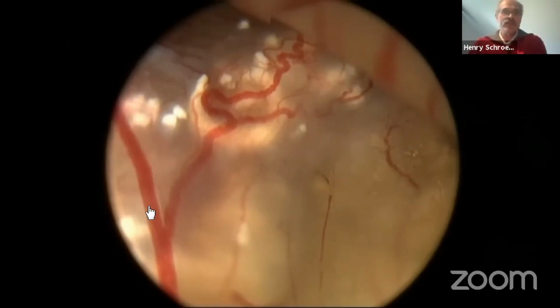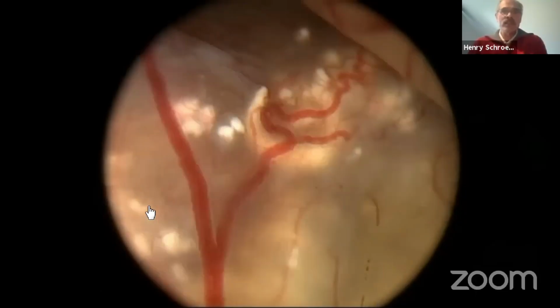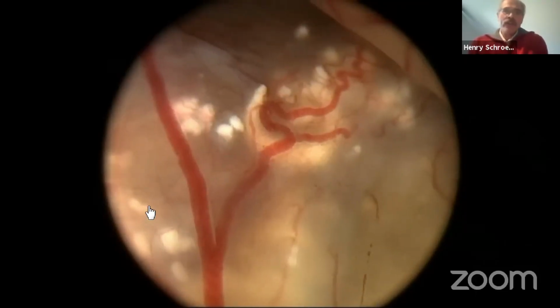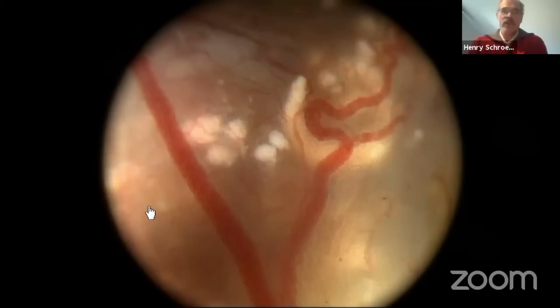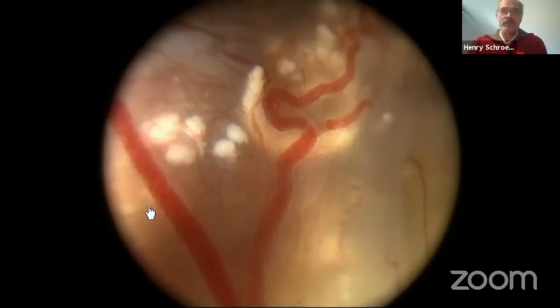Such high resolution you can get with an HD camera, and also the magnification if you have a good endoscope. So still, although we have chip-on-the-tip technology available today, the best quality is still with a rod lens endoscope, which is attached to an HD or 4K camera.